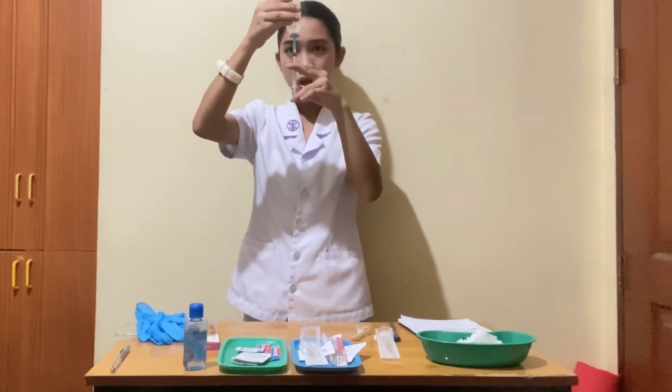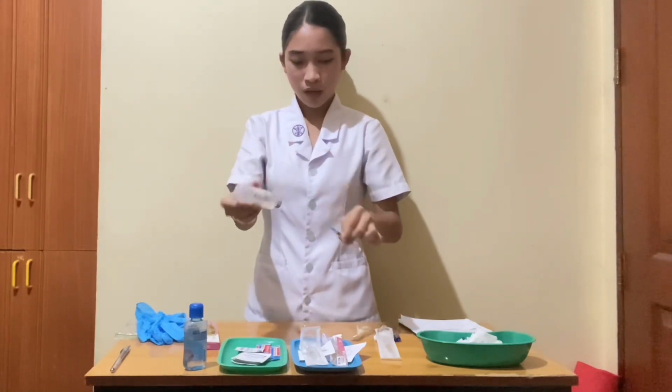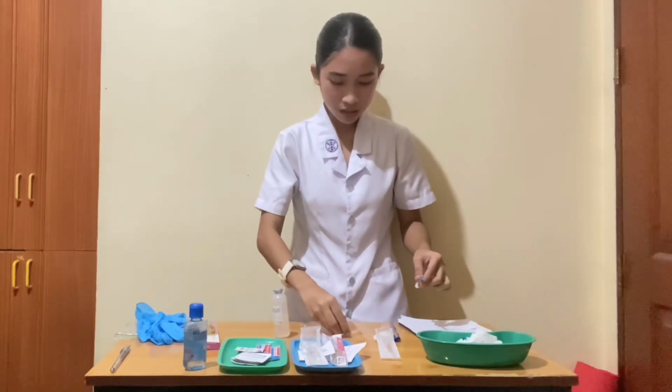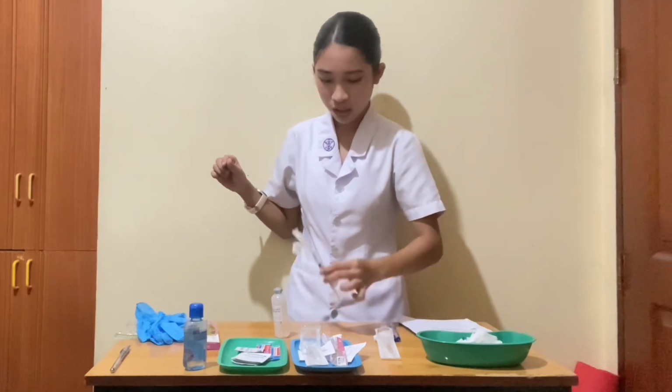Then I'm just going to recap it to avoid pricking with the needle.